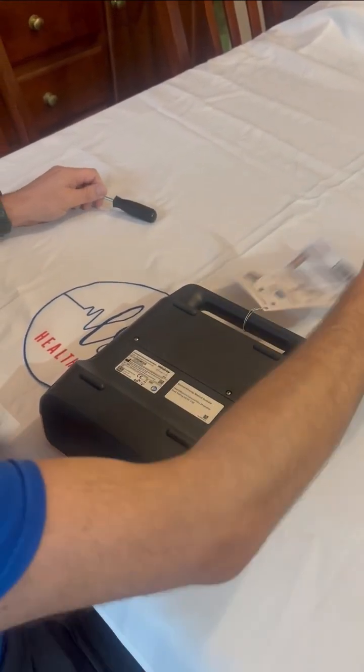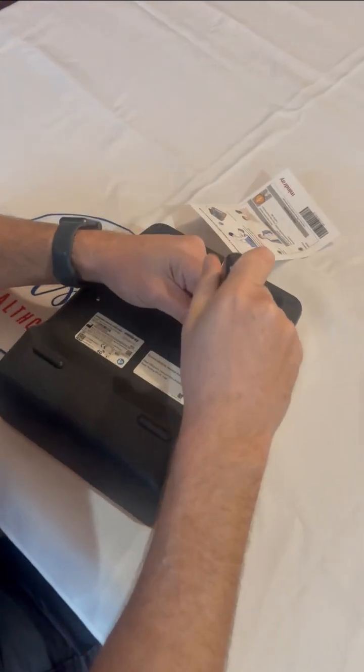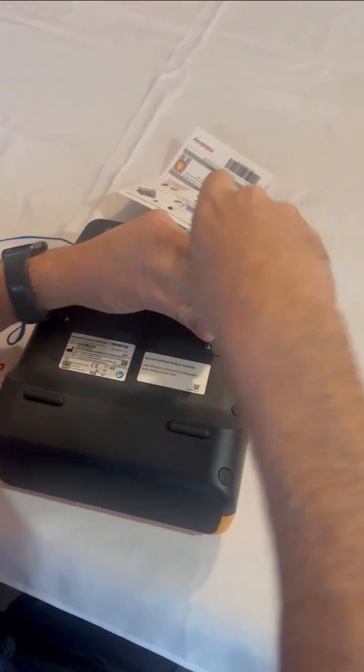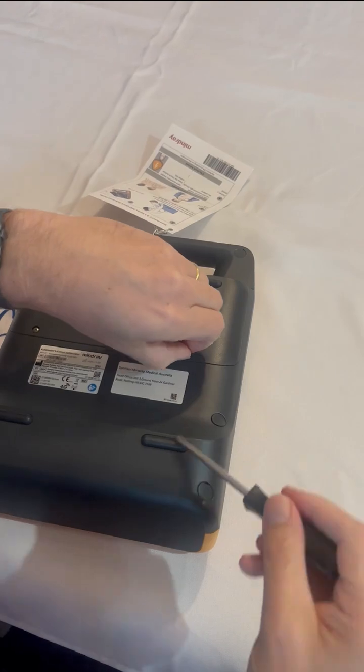Locate the battery compartment at the back of the AED. Using a star screwdriver, carefully remove the two screws securing the battery cover.